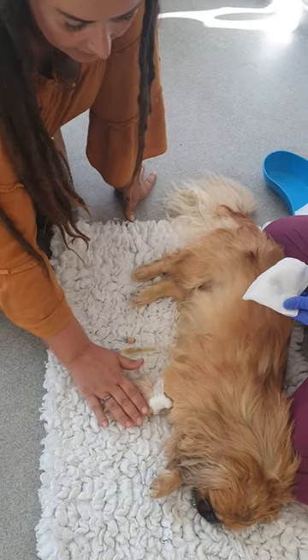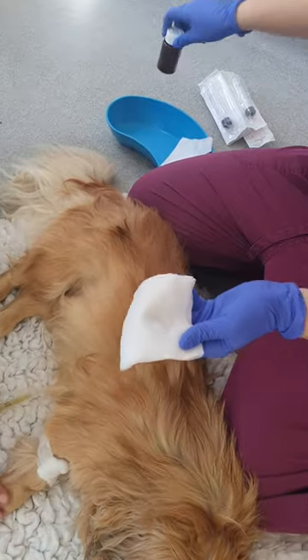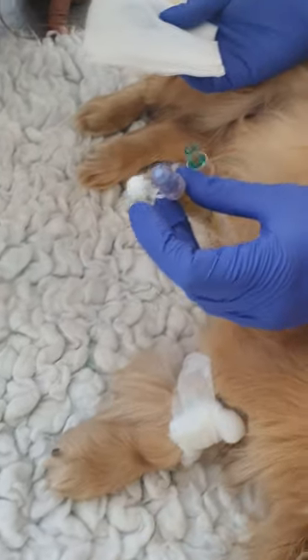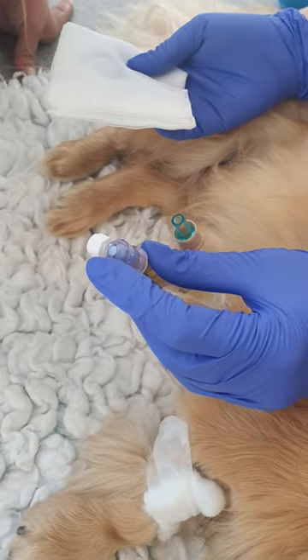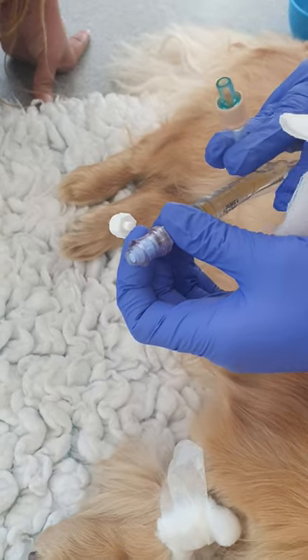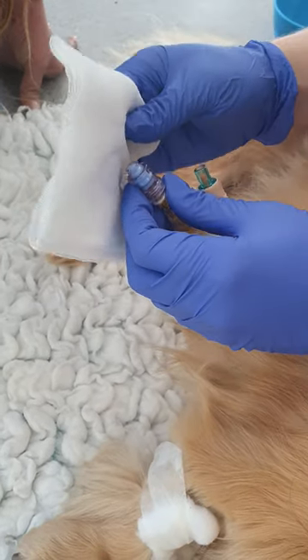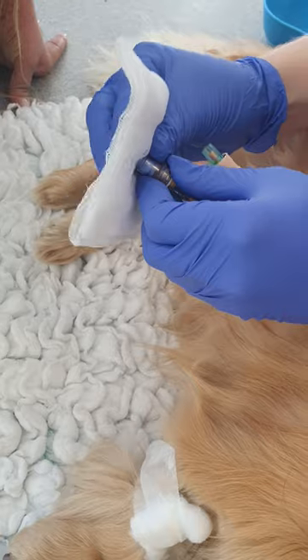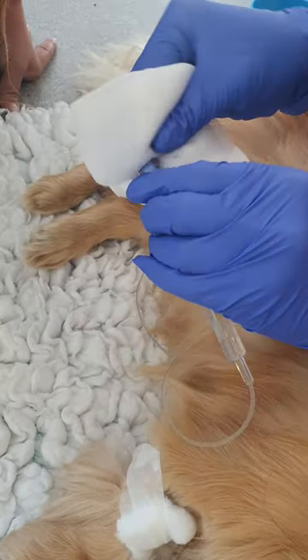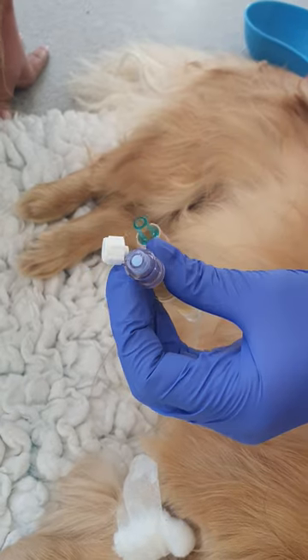You're going to be alright. So this is the end that you want to be suctioning out of - not this one, because that one's the water that's keeping the catheter in. Just give it a little bit of spirit on the end there, and that should just get rid of any sort of nasties on the end.